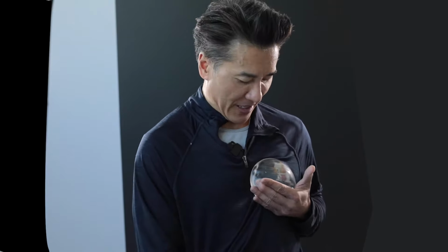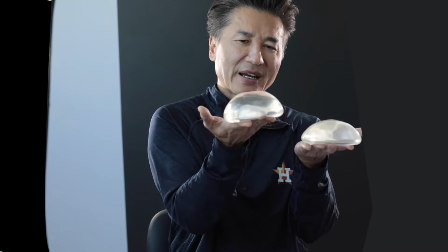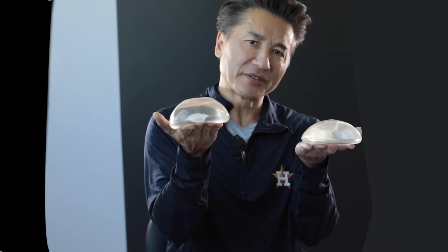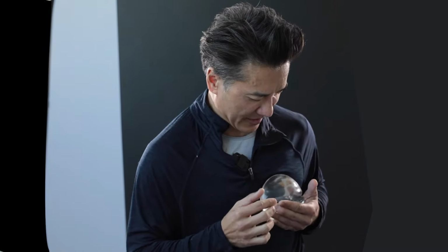And then certain implant types make rippling more noticeable, okay? So this is a silicone implant. It's a high profile implant. This is an ultra high implant, and I typically like to use the ultra high because there's less rippling, and I'll explain that in another video. But for this particular purpose, I just want to show people what rippling is, okay?